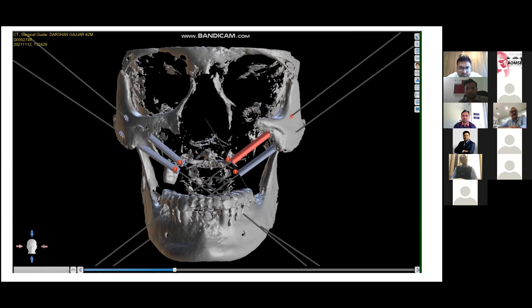Second thing, as Dr. Haran said, long-term results are still awaited. We are trying to actually do a hydroxyapatite coating of a few screws, so that at least two or three screws which are going inside would get osteointegrated. And third thing is, I think the diameter of the screw is most important here. Most of the PSI I have seen is 1.5 millimeter diameter, which is not going to hold the load which is coming from the occlusal side. So it has to be either 2 or 2.3 millimeter. And a few of the screws, you have to use a locking screw basically. So the total number of screws should not be less than at least 9 when you use this PSI on either side. Okay, and total 18 screws. But see, it is a newer thing and we are still awaiting the long-term result.